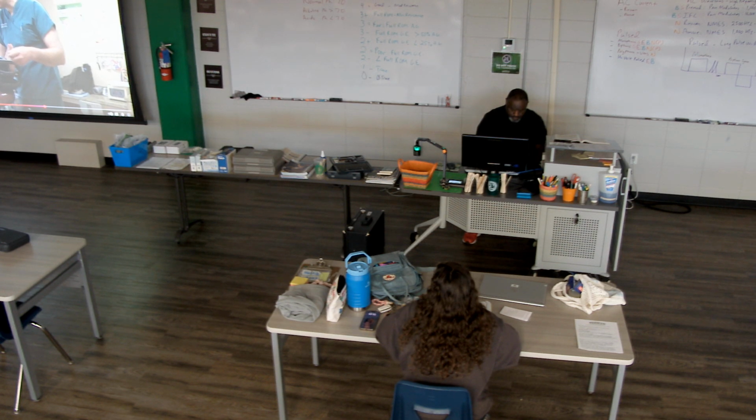So I've set this on her ankle, and I'm going to strap it down. I want it fairly tight. I want it what I call tight but loose. What that means is I want it loose enough that she's not in any type of discomfort, but tight enough that she's not wobbling around while the device is on.